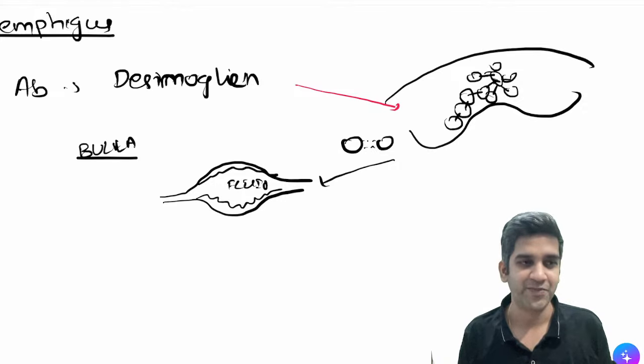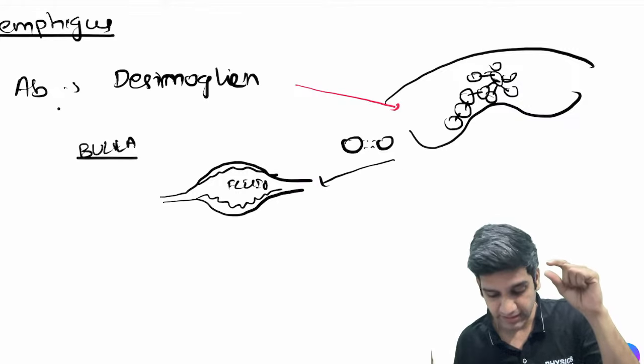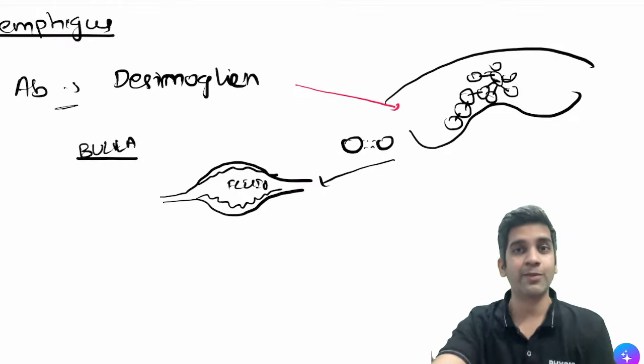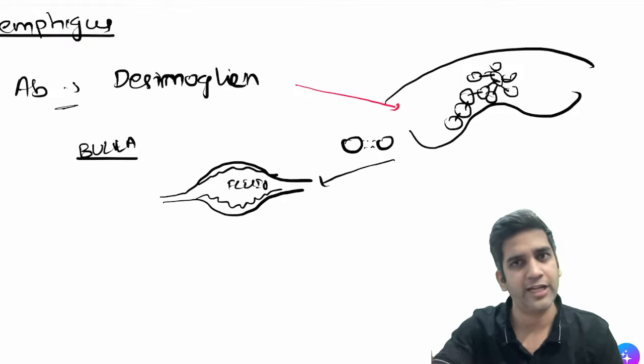Come on, guys, answer. So now my job is to diagnose them. So what should I tell? The antibody is actually binding to the skin. If I'm able to tell that to a dermatologist, they'll be very happy. This is the exact pathogenesis of the disease. So my diagnosis is sorted, right? Perfect, Rajdeep. That's how it is.